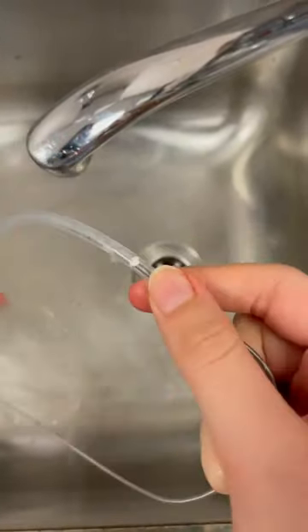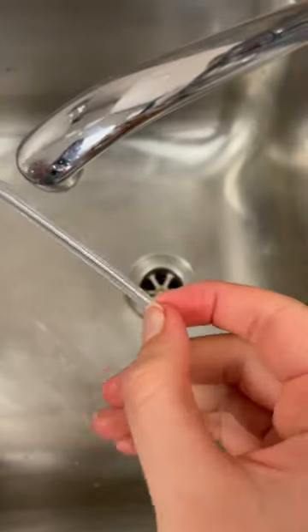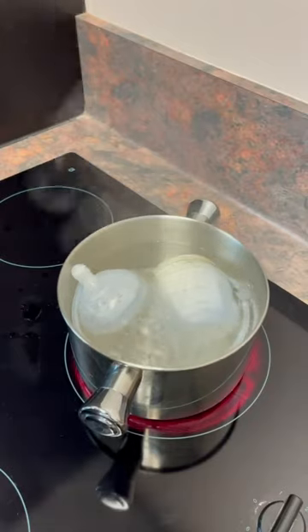This set also comes with a thin and flexible brush that can easily fit through the thicker tube to clean it. And of course all of the silicon parts can be sterilised in boiling water or any steam sterilising system.